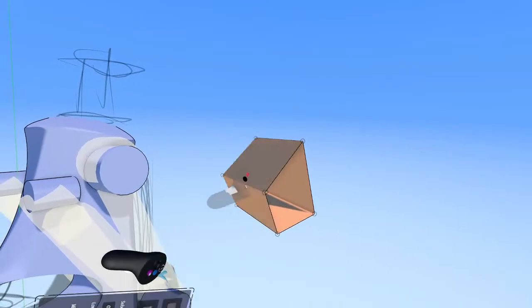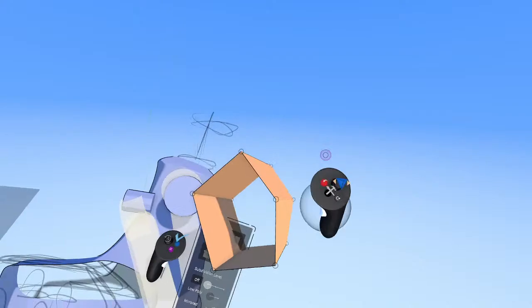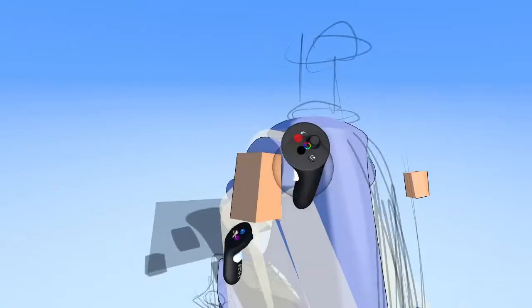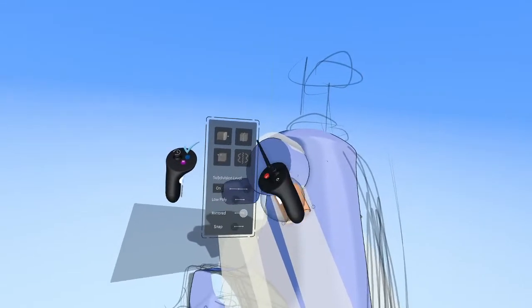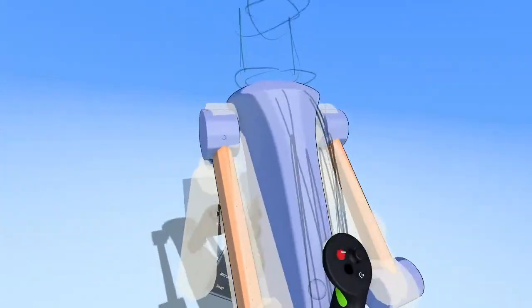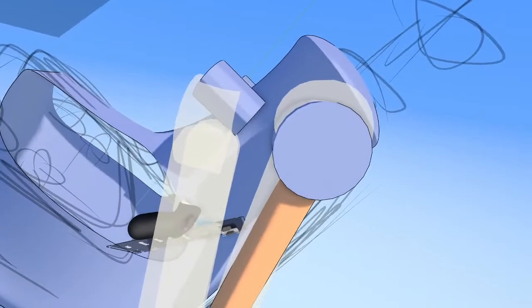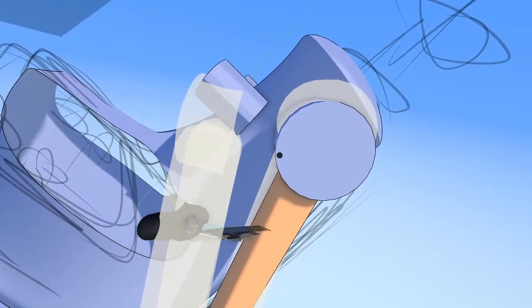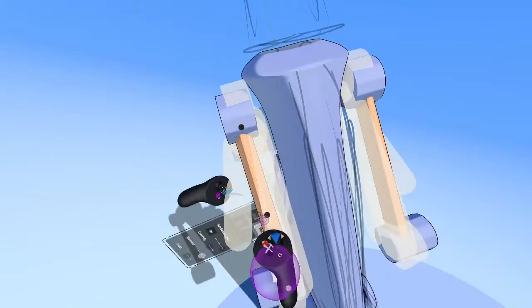Let's add another edge in. Let's just shift it around like this, get a weird shape that we want. All right, that looks pretty good. Shrink it down, place it right there. Turn subdivision on, turn auto edge loops on, and now we can drag out that arm like this. And we can grab these edge points here and just move them around in a very experimental shape for the arm.